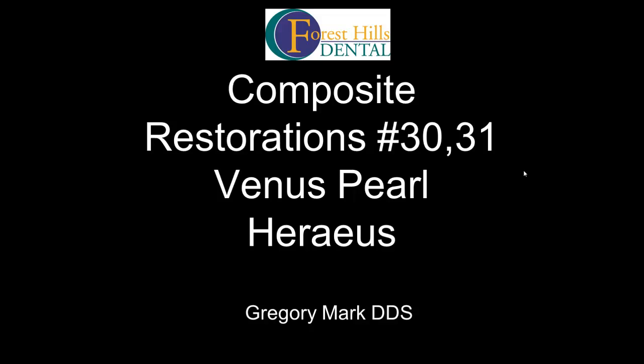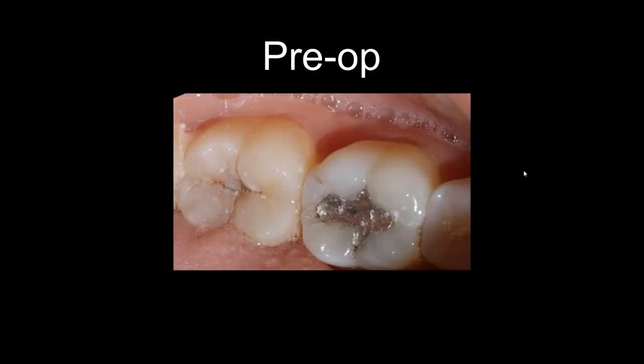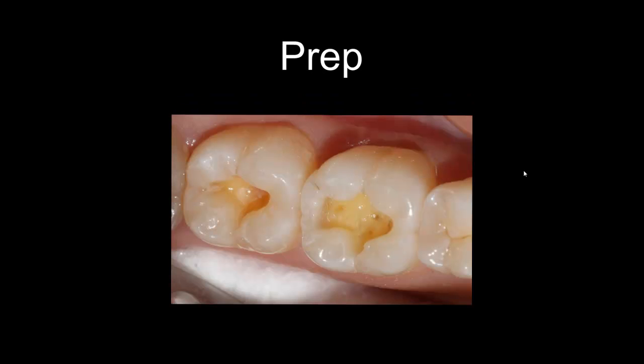The patient came in for occlusal cavities on numbers 30 and 31. Tooth number 30 has secondary decay around the amalgam filling that we need to replace with composite. So how do we approach this case? We remove the cavity — you can see the small cavity on number 30 — and try to remove it conservatively.